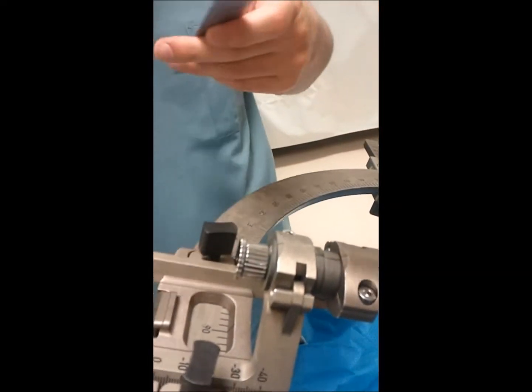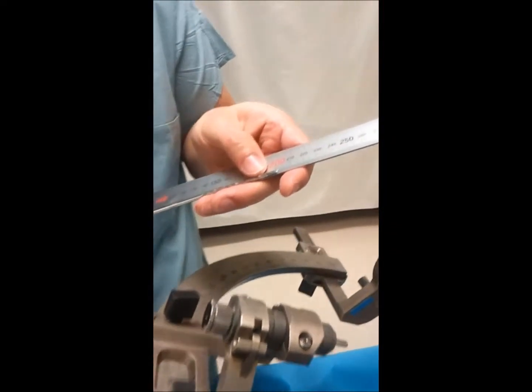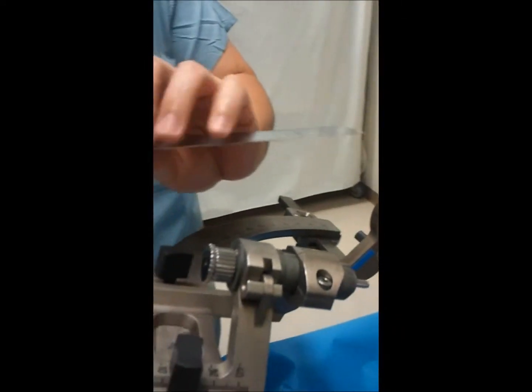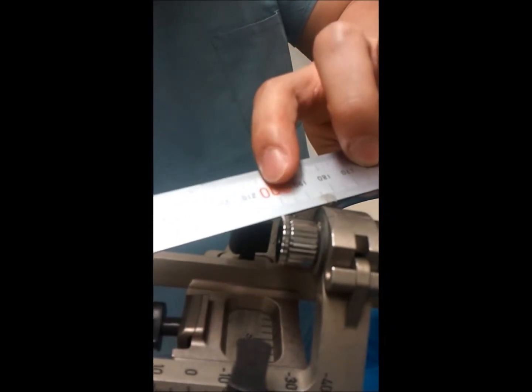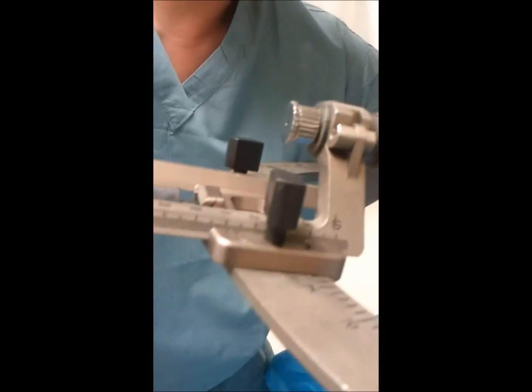And then any type of stereotactic biopsy will get you to 202 on the ruler, because you add the 190 from the black line, excuse me while the head's moving, and then another 12, which will get you to 202. And that's a pretty common number that we remember.